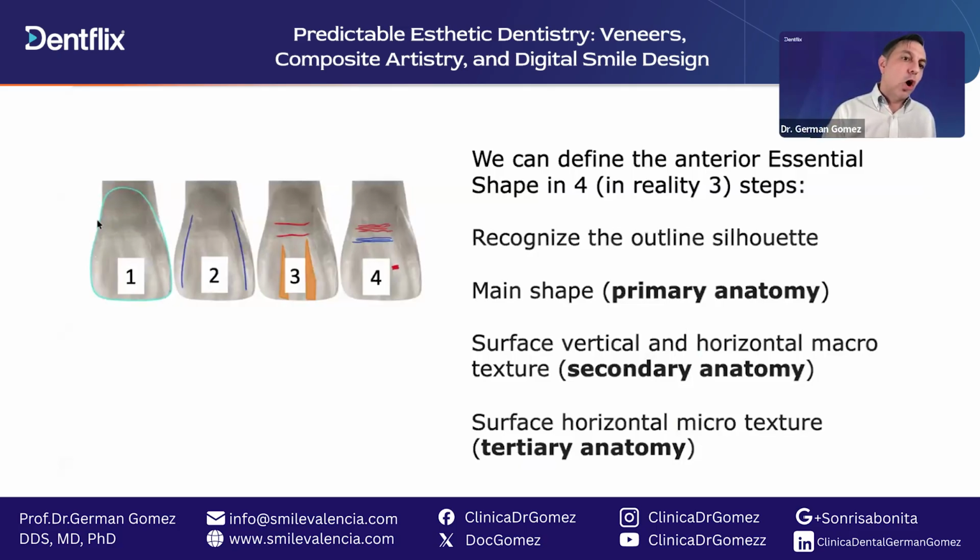Is it more long? We always look at the other teeth, and we try to imitate our filling with that. Usually when we have a class 4 filling to do, we fill up all the tooth, and then from there we just polish away and we make the anatomy. Okay, we design the anatomy.